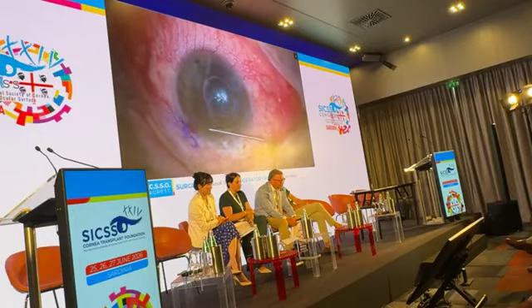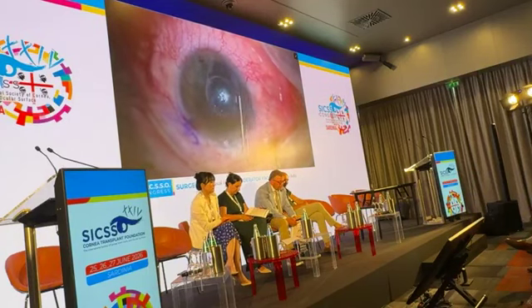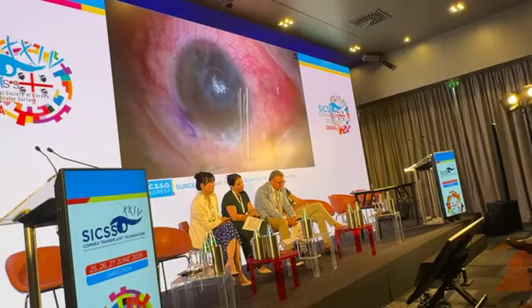So now he is doing a few more maneuvers to center the graft back into position. Sometimes it happens. It shifted a little. So with very careful maneuvers, he is recentering the graft, looking at the outside mark and the well-marked graft in the eye. A little eccentric, still a little eccentric.